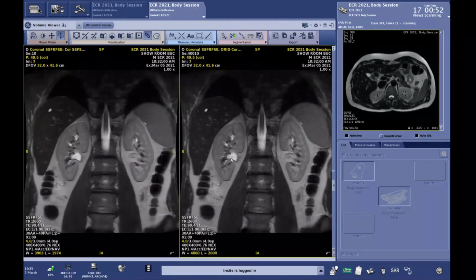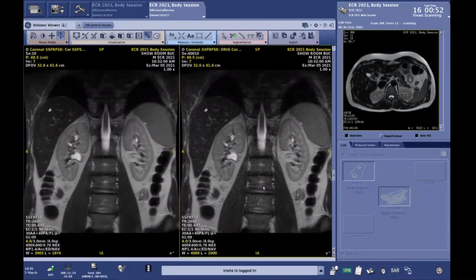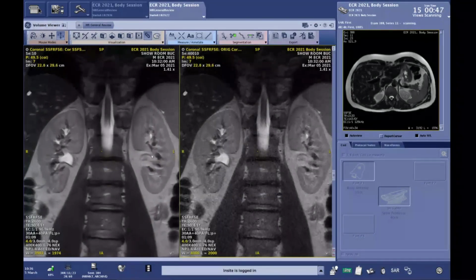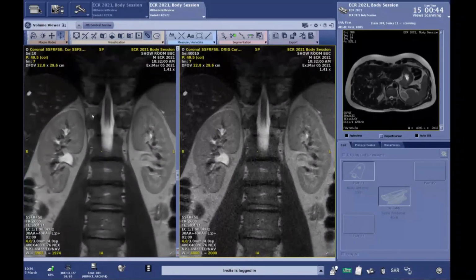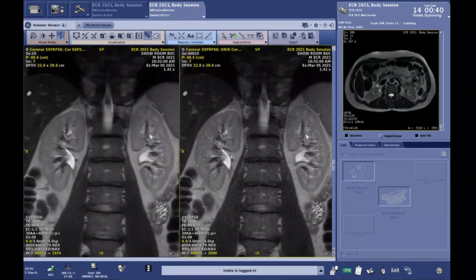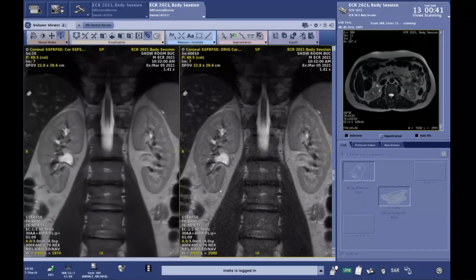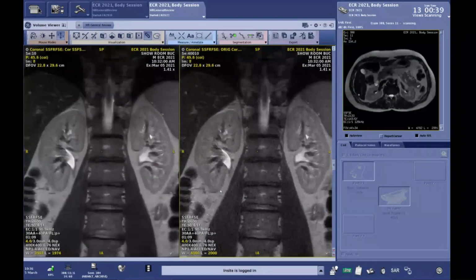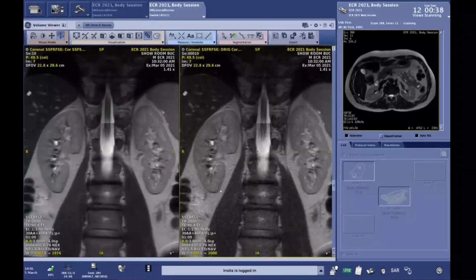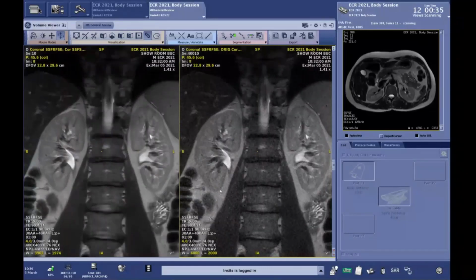We can achieve this kind of image quality thanks to ERICON-DL. As we said, we apply ERICON-DL at the k-space level, so we can also reconstruct the raw data without using ERICON-DL. Here, if we compare the same raw dataset, on the left using ERICON-DL and on the right without ERICON-DL, we can see the quantity of signal we are saving and why we can scan faster, because we have no fear of SNR penalty while improving the spatial resolution of our images.